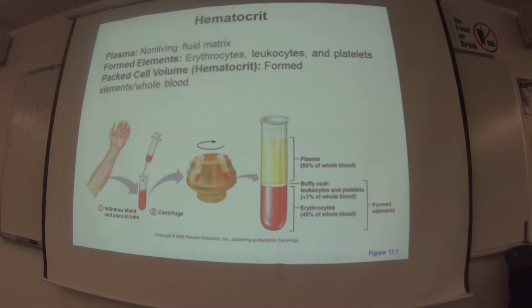The other one is hemoglobin concentration, where you're actually putting your own blood. So this week you're going to be dealing with blood, so please, you don't need to wear gloves, and it would be very hard to prick your fingers and take blood with a glove on. But as long as it's your own blood, it's cool.